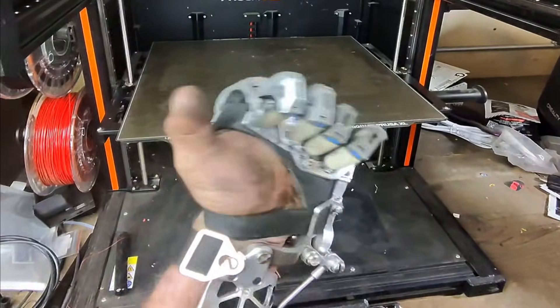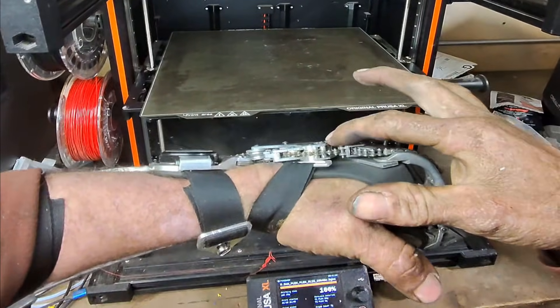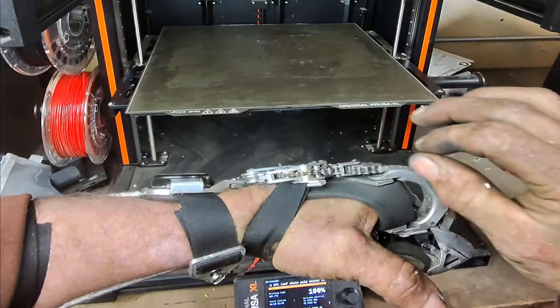Check it out, this is my new hand. I have the leaf chain winder, so it's about an eighth inch skinnier here.